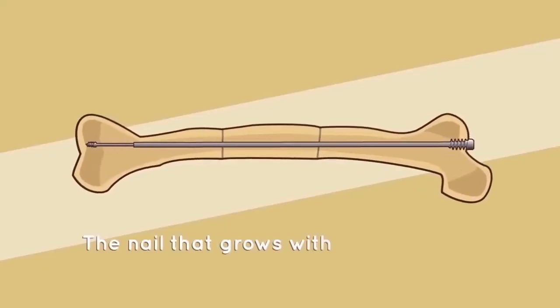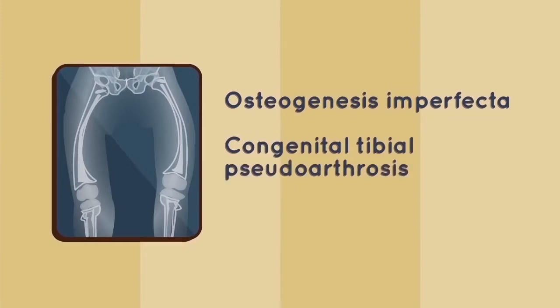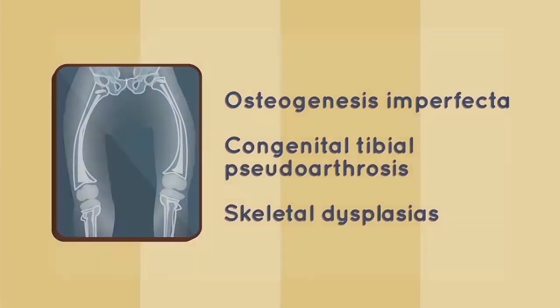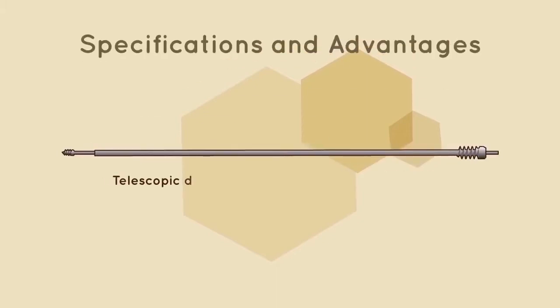The nail that grows with your patient. The gold standard in treatment of osteogenesis imperfecta, congenital tibial pseudoarthrosis, skeletal dysplasias. Specifications and advantages. Telescopic design reduces reoperation rate.